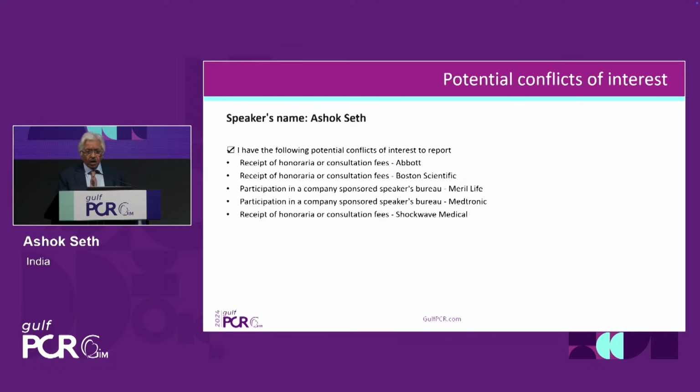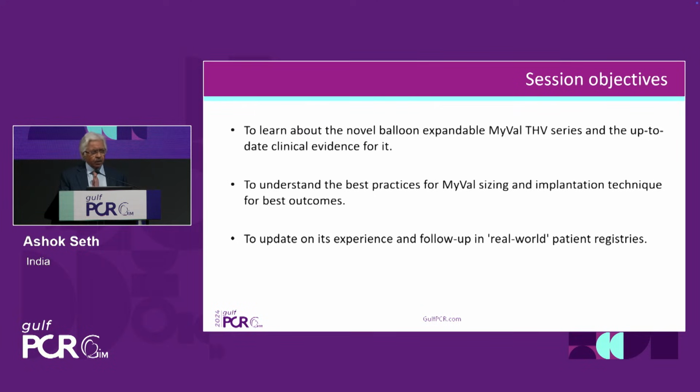Here, my conflict of interest. We're here to learn about the novel balloon-expandable Myval THV series and to update ourselves on the clinical evidence around it. We want to understand the best practices, the step-by-step implantation, sizing, and implantation in the best possible manner for our patients. And we want to update ourselves on its real-world experience through patient registries and large center experiences.